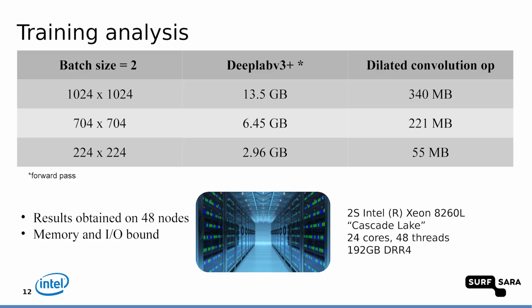Batch size actually helps with hardware efficiency when you have memory for it. About 2017, 2018, a group came with a 704 by 704 patching mechanism for this type of images, and they showed significant improvements in prediction quality.